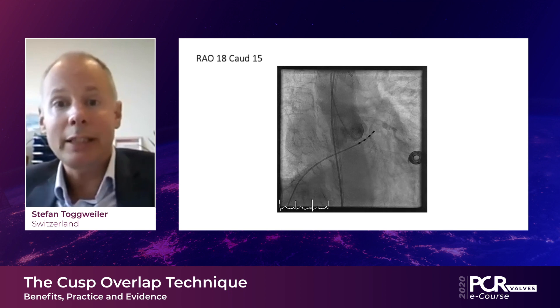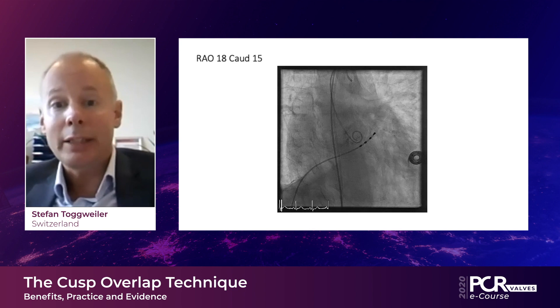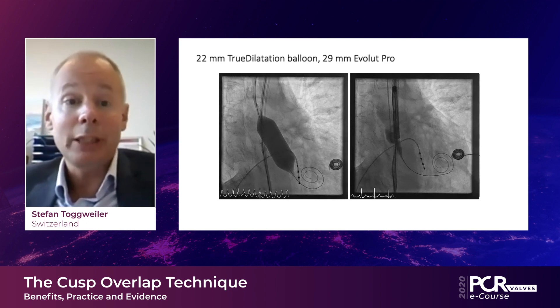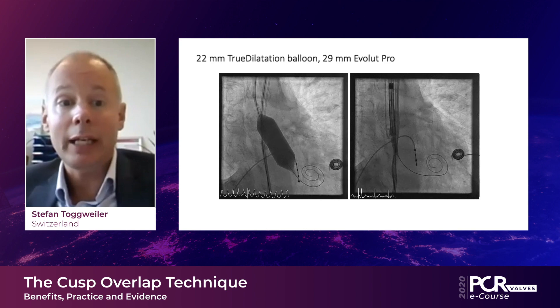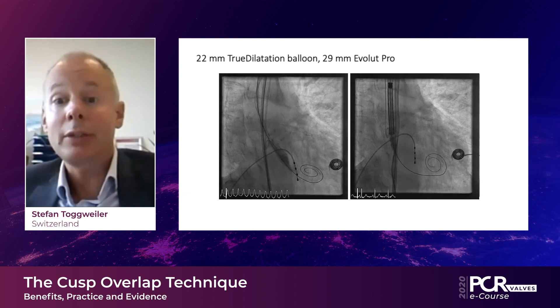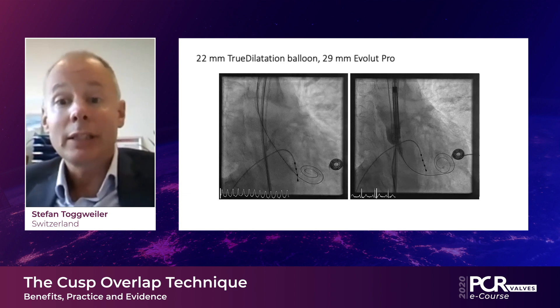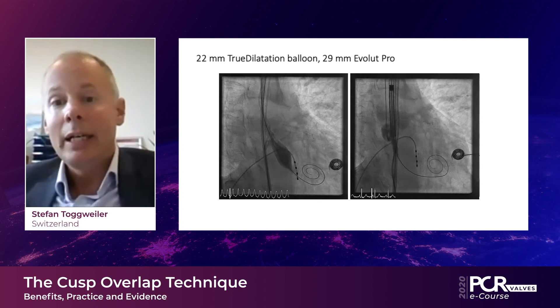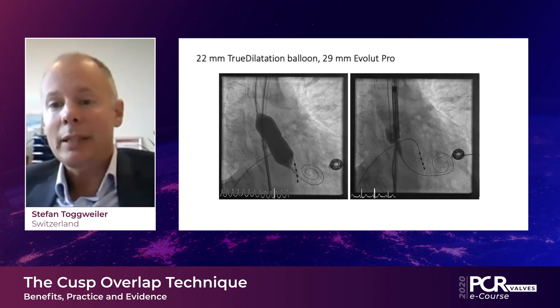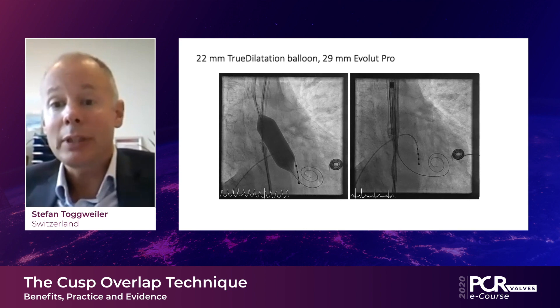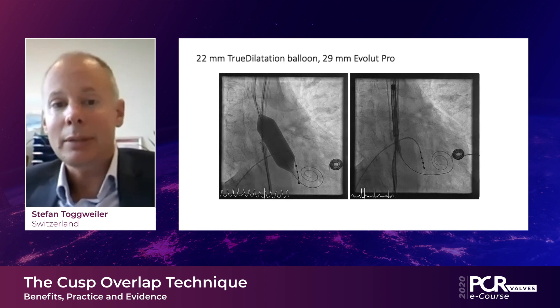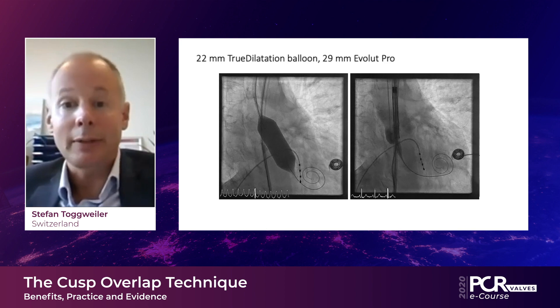This is how we performed the whole procedure — there was no switching of angulation during the procedure. Pre-dilatation was performed with a 22-millimeter balloon, which is quite careful given the lot of calcification. Then we started deploying the valve. On the right side you see the starting position where we actually start to deploy the valve — we are still very high, a few millimeters above the annular plane. This is because usually the valve will travel a little bit down into the LVOT during the first turns, and this ensures that there is minimal contact between the conduction system and the delivery catheter.